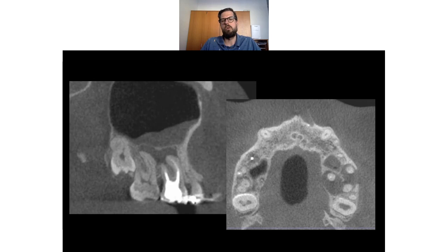Another case, when I see in a small intraoral X-ray that there is a big lesion, I normally send the patients for CBCT, and here you can see that there is a problem in the antrum. There is a thickening of the mucosa in the antrum, so you can go for the endo, but you must be very careful if you are doing a down pack. For example, now here I would decide to work with some calcium cements or with mild pressure so that you don't overtreat the canals, and in worst cases you can push some sealer inside the antrum. In such cases the recall after 1 year should also be a CBCT, so that you see the situation in the sagittal view.